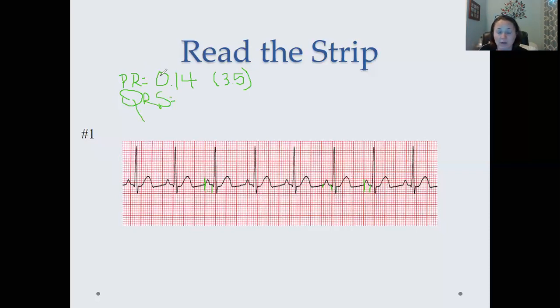That said, I know the question you're asking is, well, I only got 3 squares, I had a little over 3.5, and I thought it was closer to 4 squares. There is going to be a little bit of leeway when people read it, like 1 box give or take.